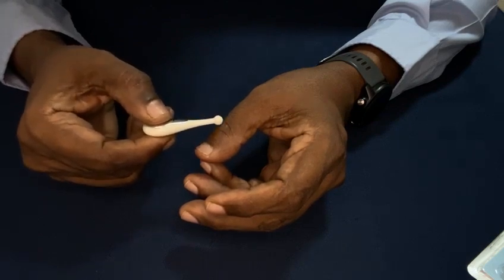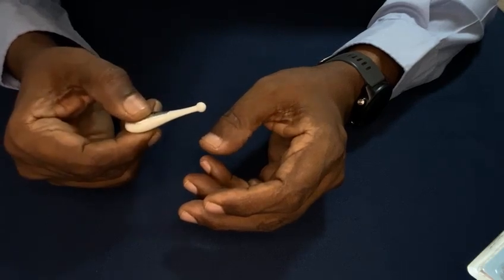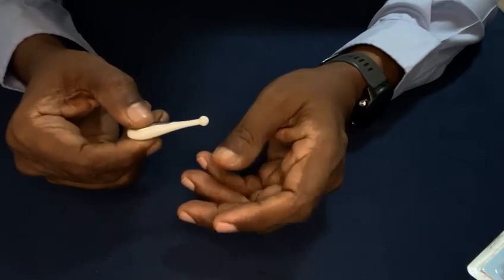So that means for a second or two you are activating the battery. If the patient gets the vibration, then you are switching off the vibration. So one to two seconds is sufficient to test one spot.